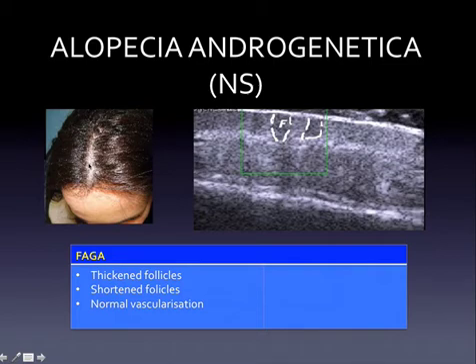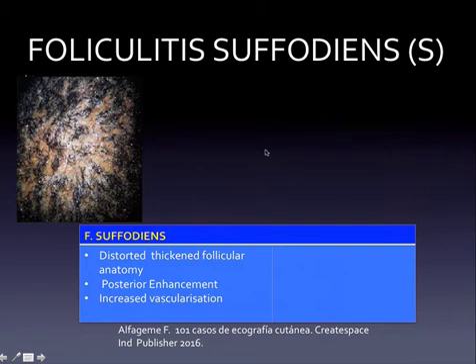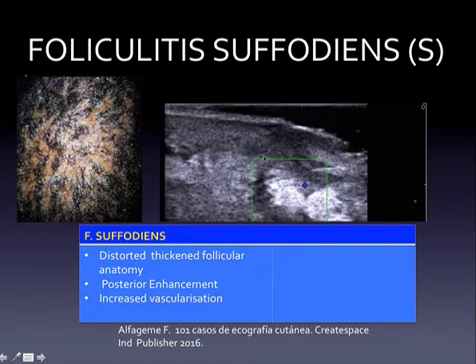This is a case of female alopecia androgenetica. Regarding scarring alopecia, the most important is folliculitis decalvans, which is very common in phototypes with darker skin. What we would see is a distorted and thickened follicular anatomy, sometimes with posterior enhancement and increased vascularization — reflecting the distortion of the normal follicle structure observable in these patients.